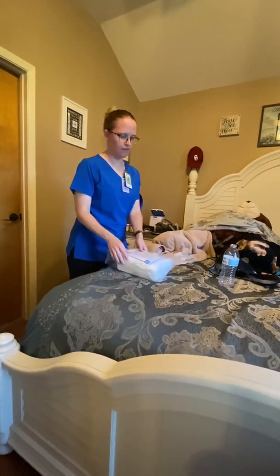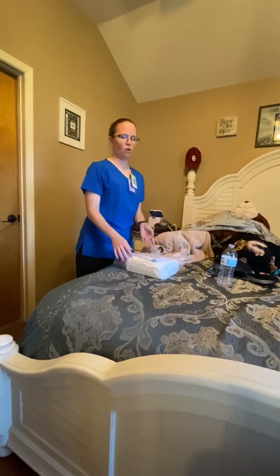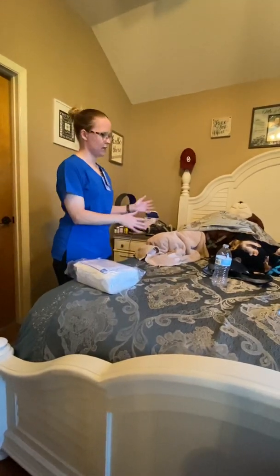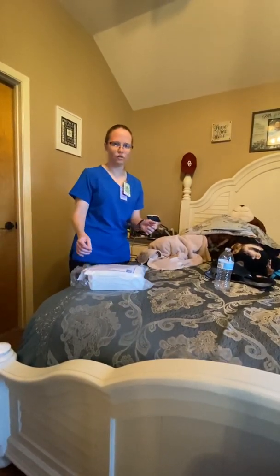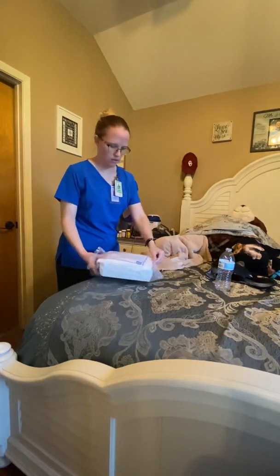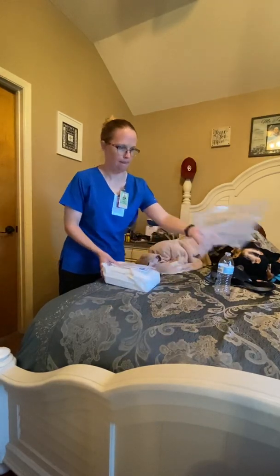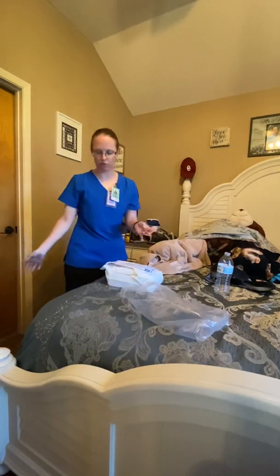Next, we're going to get our kit. We can have the kit either with the patient on the bed, which is preferable depending on the patient, or we can have it on the table next to the bed. But this patient is good, so we're going to keep it on the bed with the patient. We've got to make sure to keep a sterile environment with this kit. What we're going to do is take out our kit. We can also use this bag as our trash. Since we don't have a trash can, we're going to act like that's our trash can.